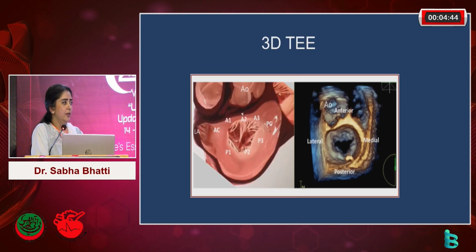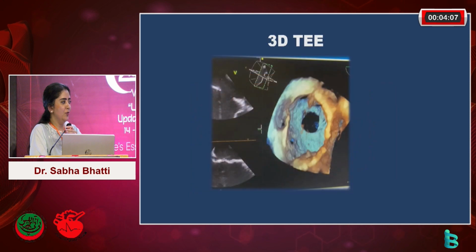So switching gears and coming back a little bit to 3D TEE, I think everyone in the audience who's done 3D TEE knows that once you do this, there's no going back. I think 3D TEE initially came up as something that was only available in some institutions, but in the West now, pretty much a TEE has to always have 3D images. It doesn't matter if you're planning to close or not close, but at NICVD at this point, all our valve cases have 3D imaging, and most of the other cases too, with endocarditis or something interesting, we do it with our 3D probe, which we have one at the moment, but we take really good care of it.